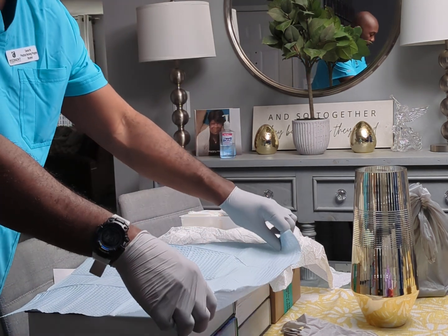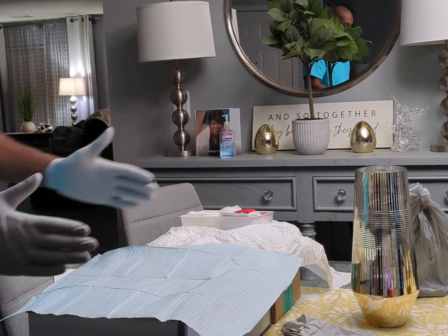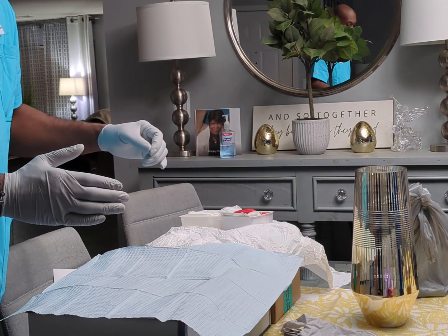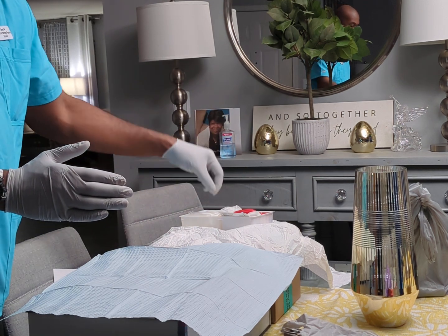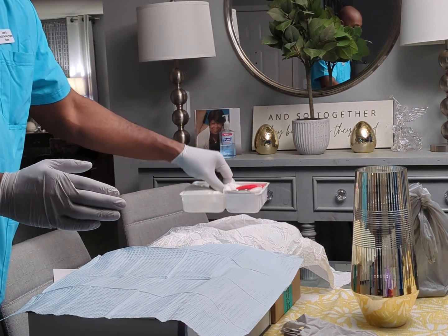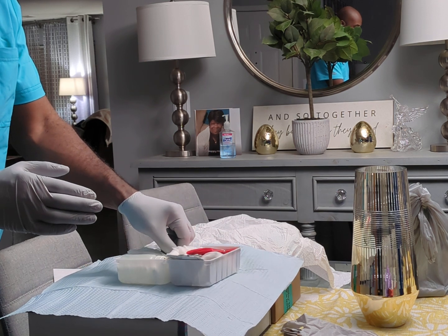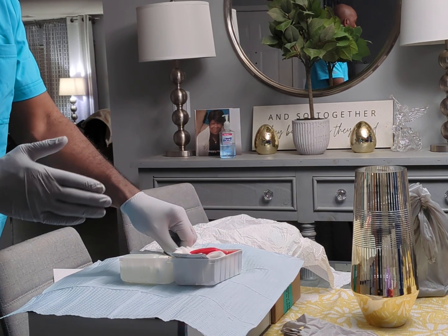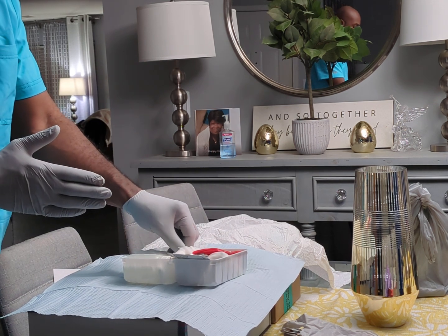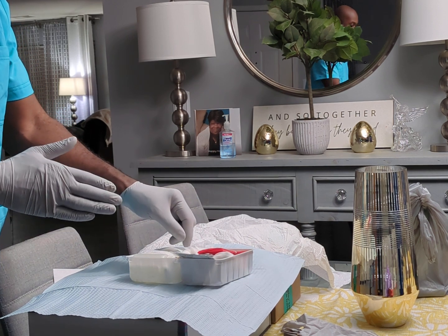And the edges, of course, it's technically not sterile. And then after that, I'm going to take my kit and either I can place it right in the middle of it, or I can dump it in. People do it different ways. I'm just going to place my kit right in the middle of it, and everything I have is inside.